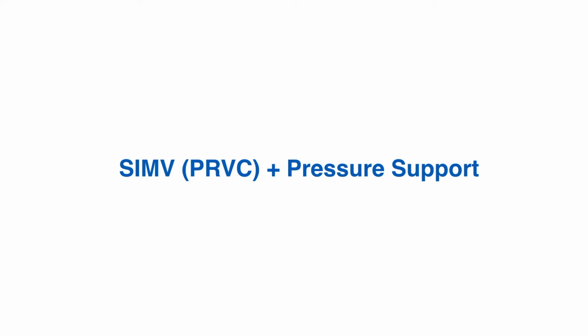And this is particularly useful if you've got patients who won't tolerate changes in CO2 particularly well. For example, your head injury patient. The ventilation is going to be fairly similar. So if this patient develops a pneumothorax, what will happen is the ventilator will need to use more pressure to deliver the same tidal volume. The alarm limits will, providing you've set them well, start telling you that the ventilator is delivering a high pressure, but it will still give you the volume, so your ventilation tends to be guaranteed.